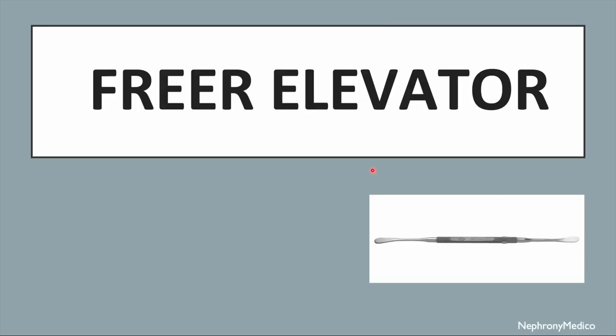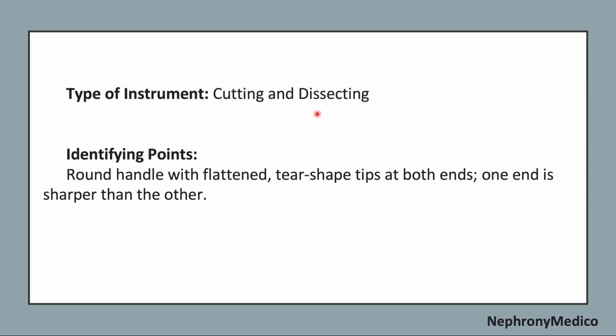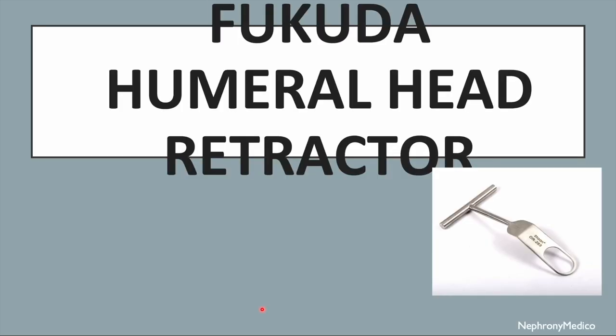Let's talk about Freer elevator. This is a picture showing Freer elevator. It is a cutting and dissecting type of instrument. Now, identifying points. A round handle with flattened tear-shaped tips at both ends, and one end is sharper than the other. Use. It lifts the periosteum from bone or retracts in confined space. The small balls of bone wax are pressed onto the tip and then are smeared on bone edges for hemostasis.